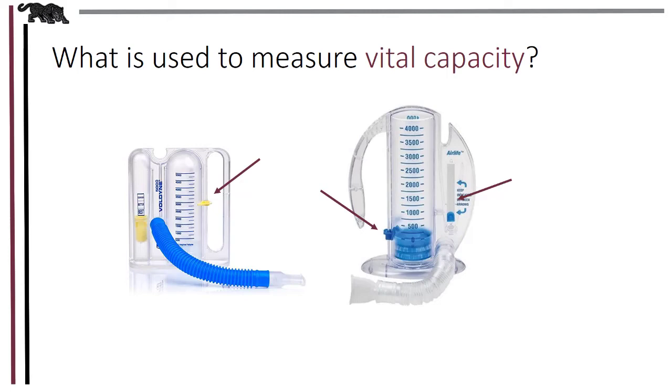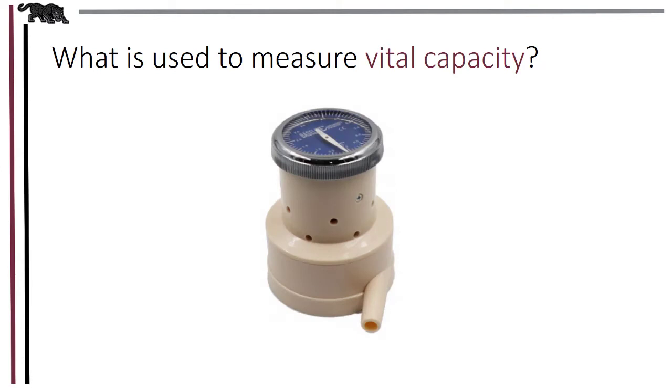Another type of simple, cost-effective, yet reasonably accurate spirometer is of the windmill type. And these are analog type spirometers, and a needle moves as the air is blown into a chamber. They're quite popular, and so this is what we're going to be using for this lab.